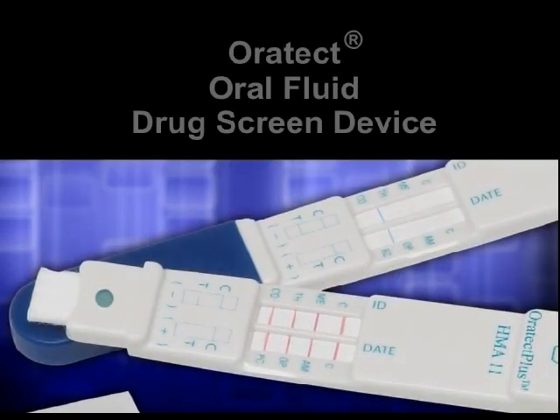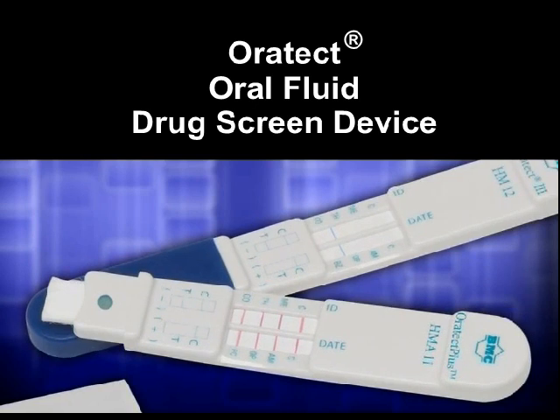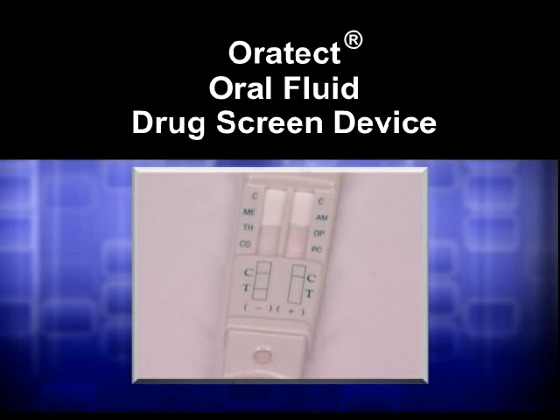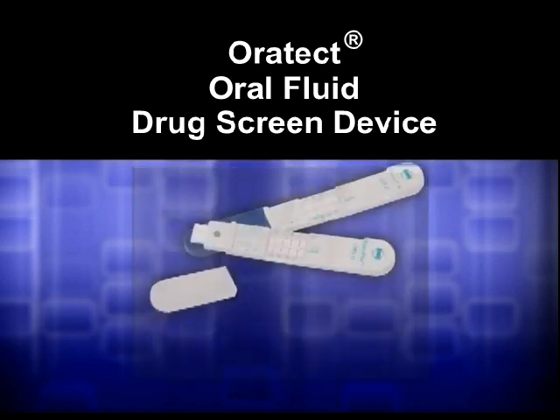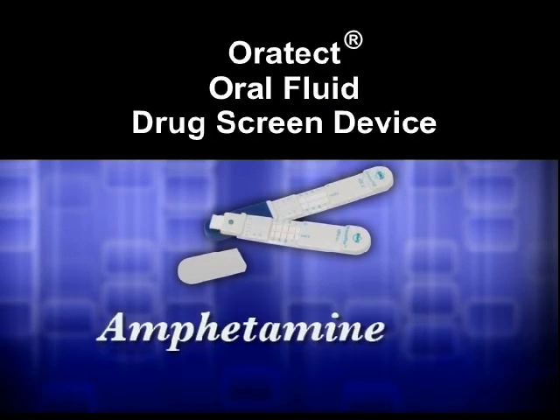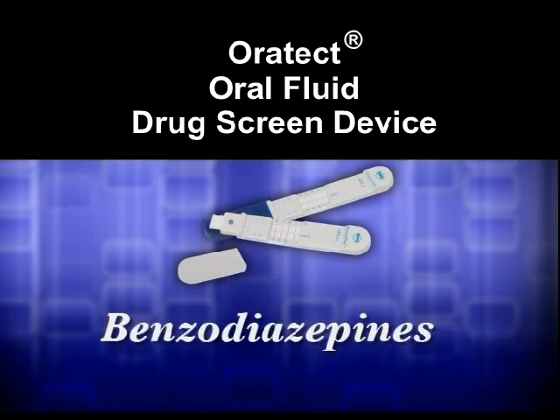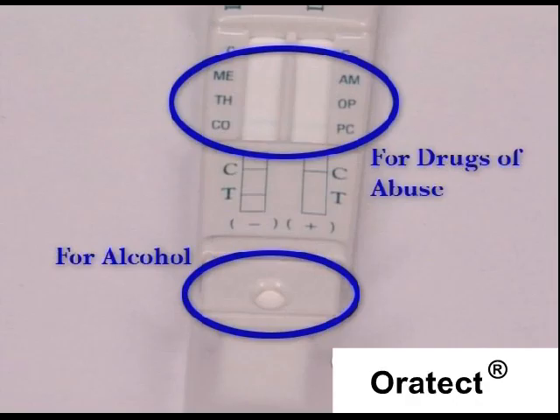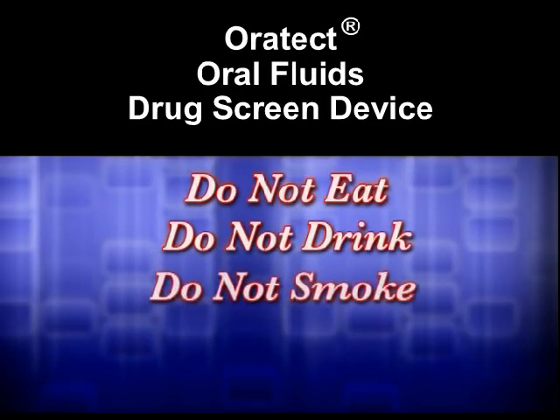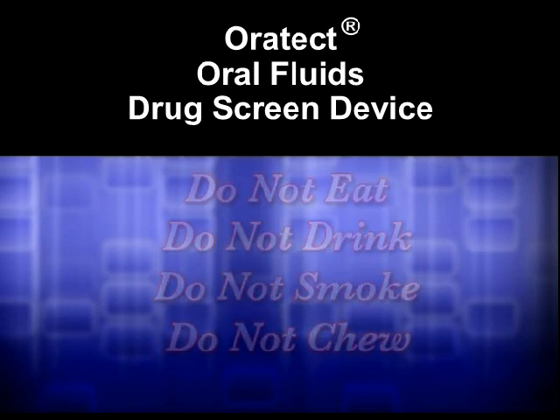Brannan Medical Corporation's Oratect oral fluid drug screen test and Oratect Plus oral fluid drug and alcohol screen device are both one-step lateral flow immunoassay devices for the qualitative detection of THC, methamphetamine, cocaine, amphetamine, opiates, phencyclidine, benzodiazepine, and their metabolites in human oral fluid. Instruct the individual being tested that they should not eat, drink, smoke, or chew tobacco products for at least 10 minutes prior to taking the test.